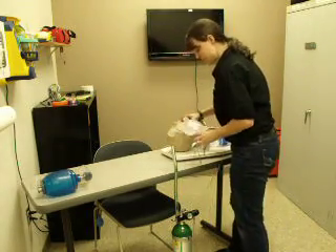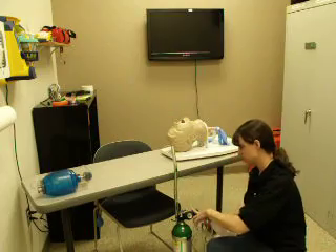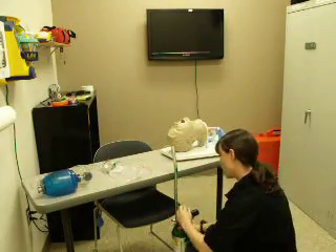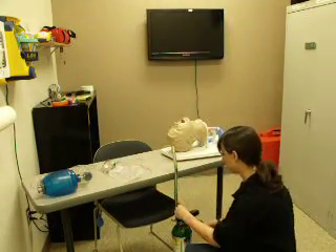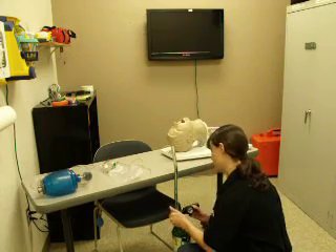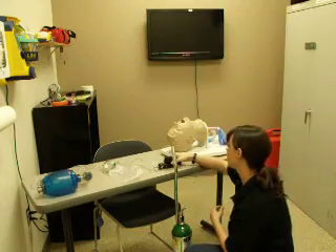I'm going to remove the mask from the patient. Turn off the oxygen. Deflate the reservoir bag. Closing the oxygen tank — clockwise is closed. And then I'm going to bleed the regulator. Remove the regulator from the tank and reset it at zero for the next candidate.